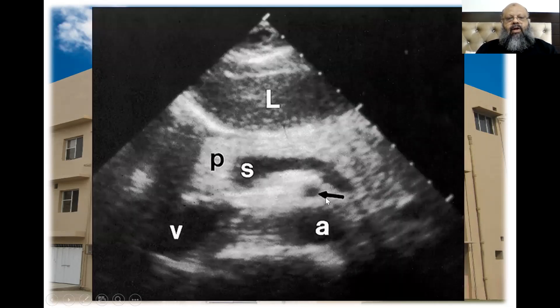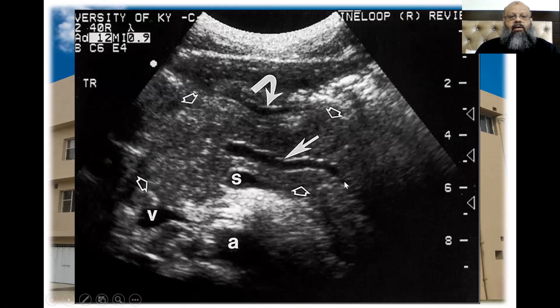There is more fat — a typical case of fatty pancreas. Here is the aorta, the splenic artery, the splenic vein, and we can identify the tail, body, neck, head, and uncinate process of the pancreas. A dilated pancreatic duct can be seen whenever there is a mass at the head of the pancreas, or there is pancreatitis — either acute or chronic.